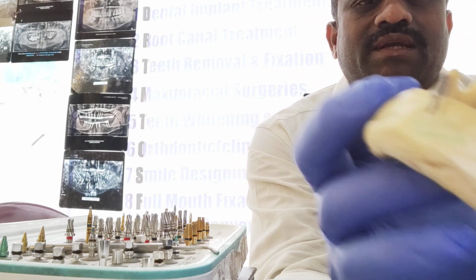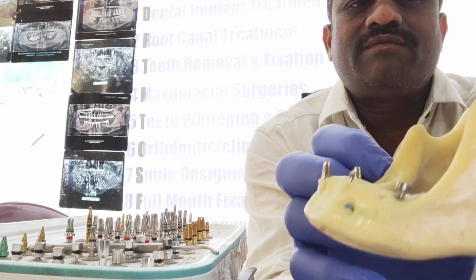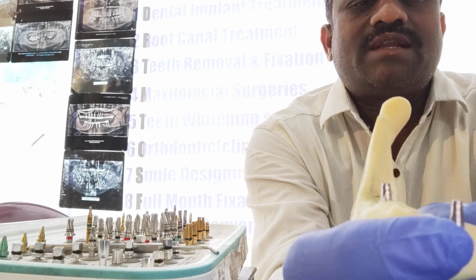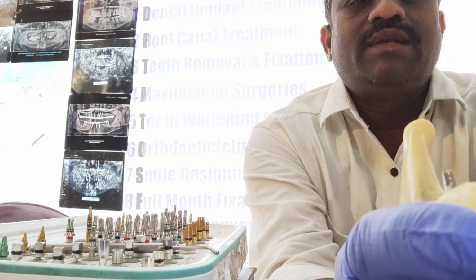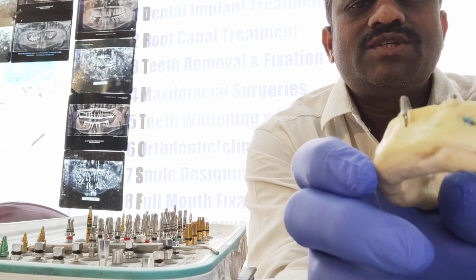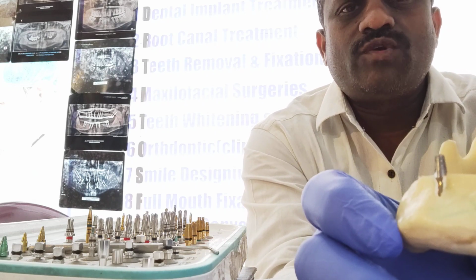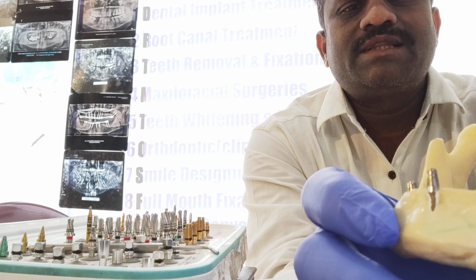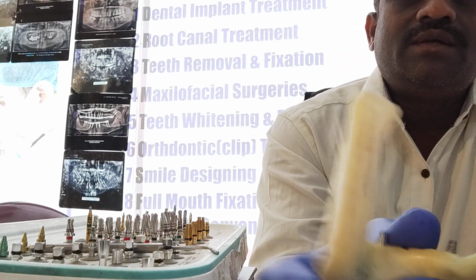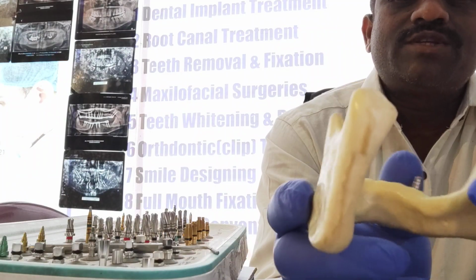So here in this mandible, there is one conventional implant placed as well as the BCS implants as well as the rough surface implant. The only thing is the bone should be good. If there is D2 bone, you will get good stability and anchorage. So anatomical structures you always have to be thorough with before placing the implants. I have explained it in the mandible. Here you can have a look. Brief explanation about the anatomy.